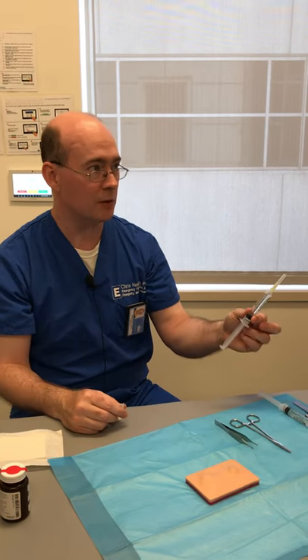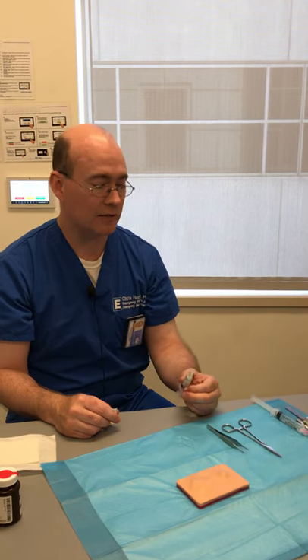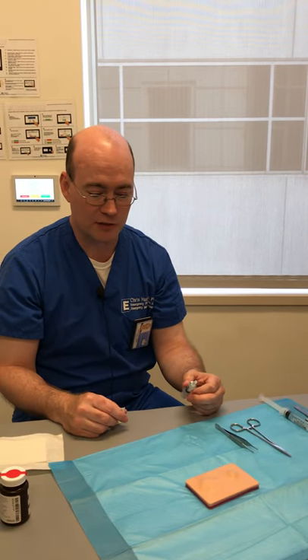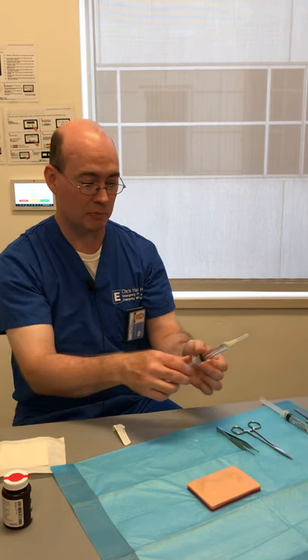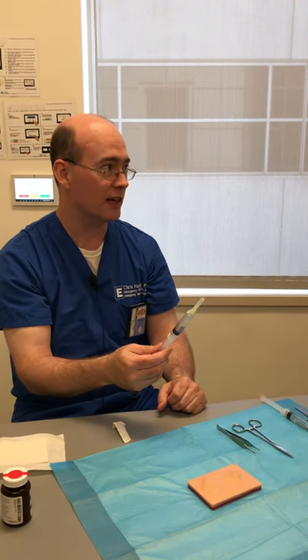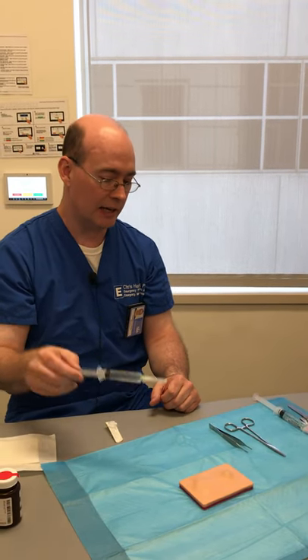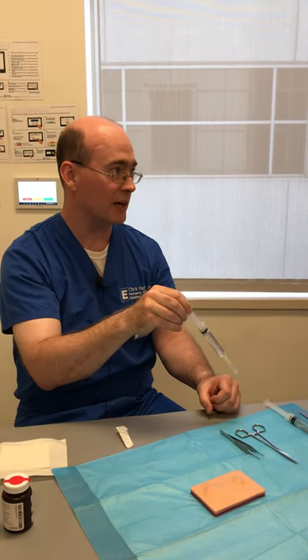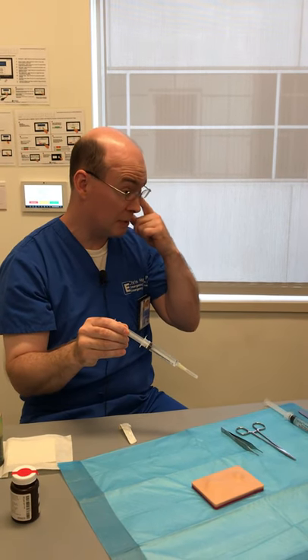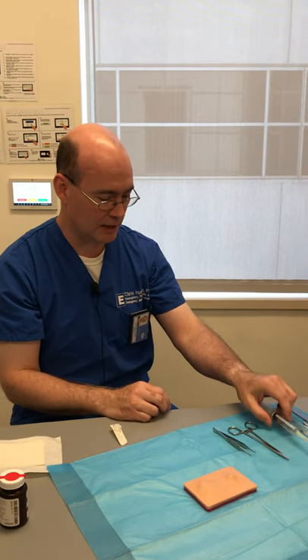You'll need something to anesthetize it with — fill up a big syringe with lidocaine. These are very difficult to anesthetize because the stuff inside is very acidic and tends to neutralize the anesthetic, and it hurts like heck. Draw up a good 10 cc's of anesthetic because you might find it's numb, then not numb — you may need to go back and hit it again. Always be very careful once you stick a patient: never put the needle back in the bottle, because the bottle can wind up back on a suture cart.